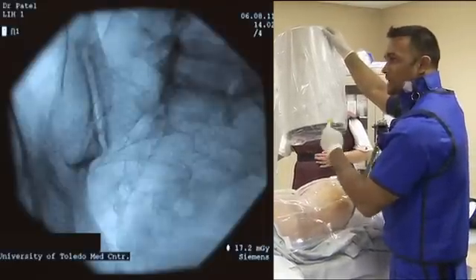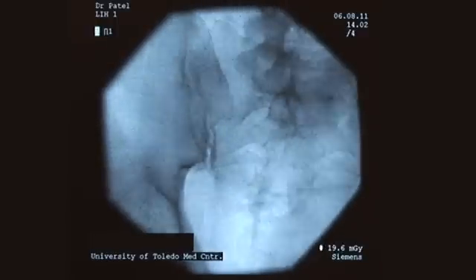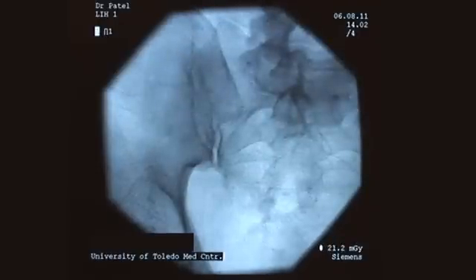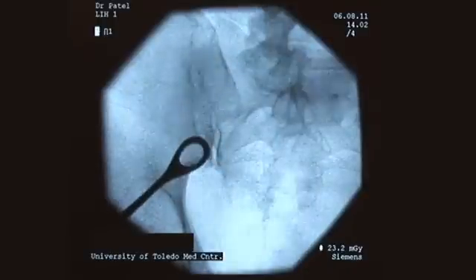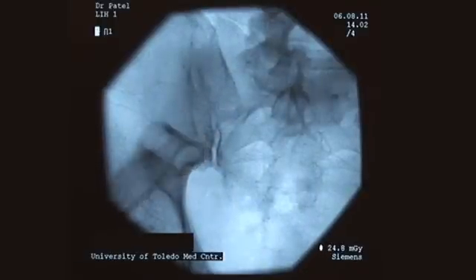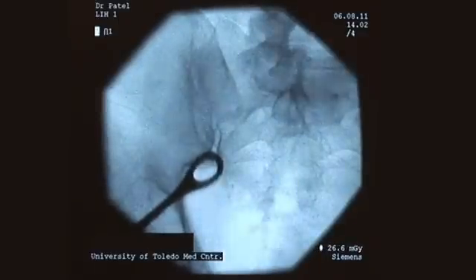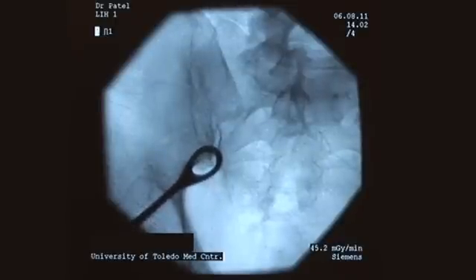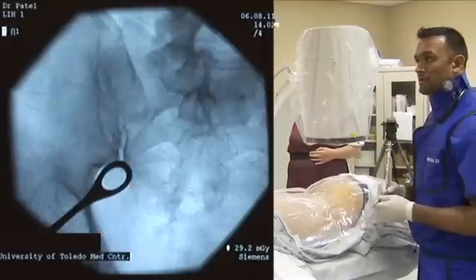Then I'm going to rotate it towards me, and what you'll notice is that the SI joint is going to start to separate — we can see our posterior joint, which is right here, and our anterior joint, which is right here, separating completely. What we think is the posterior joint, which is the medial one, is located right here. This is our opening — basically where we're going to want to make our mark and anesthetize the skin.